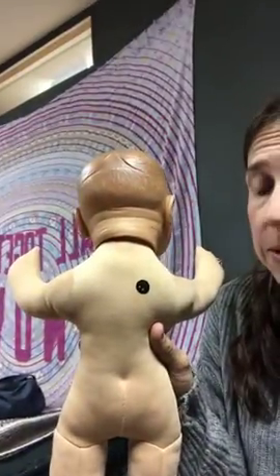And I just wanted to take a couple extra minutes and show you this wonderful baby here and where you'll be able to hear best. Of course, when a fetus is in utero and tiny, we don't necessarily know what parts are what, so we can't really distinguish butt from head at, let's say, 16 weeks necessarily. We're just kind of listening all over, and I don't have enough hands today to show you where in the uterus to listen at different gestations, but it certainly does matter as the baby grows, and you can palpate from the outside what a head is, what a butt is, what you're really going for as far as looking for where to listen.